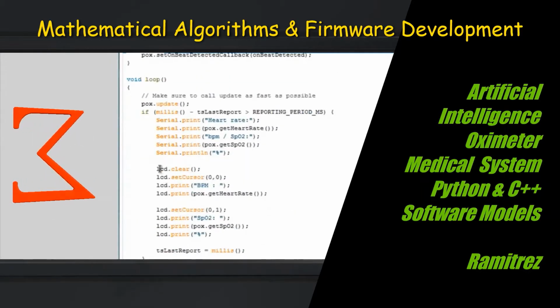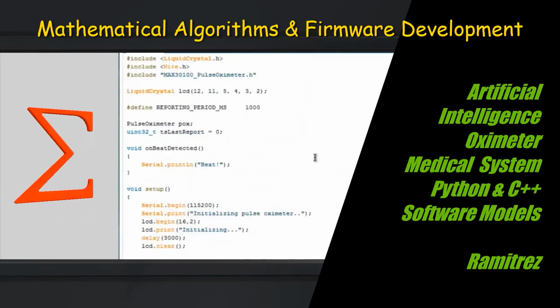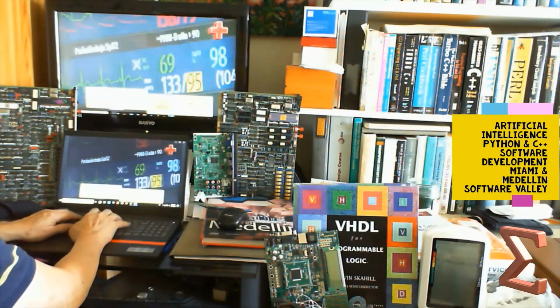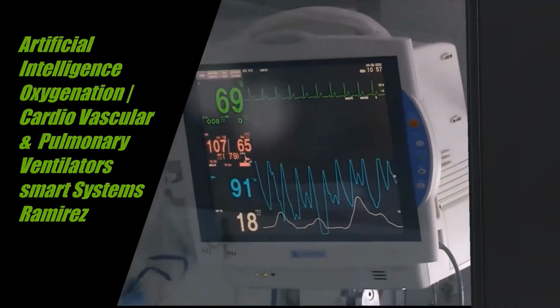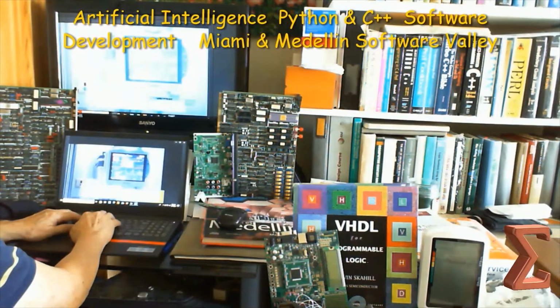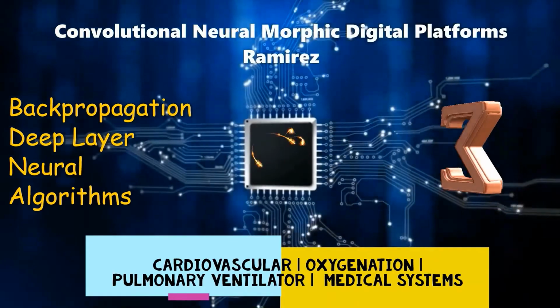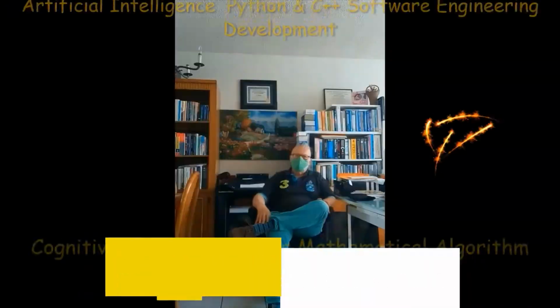The efficiency of this transport mechanism and overall system performance is analyzed and used to calculate the SpO2 of the individual within the realm of pulse oximetry. So, oxygenated hemoglobin and deoxygenated hemoglobin have different properties, and these are used to calculate the SpO2 of any individual.